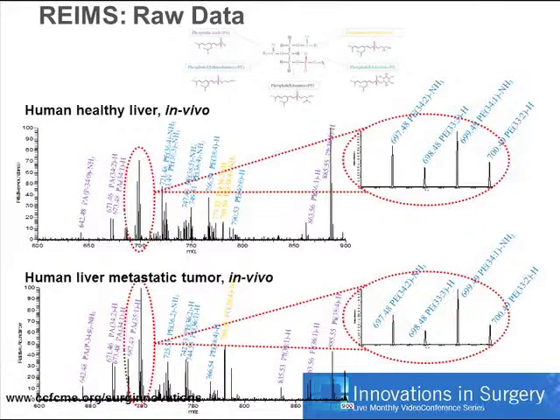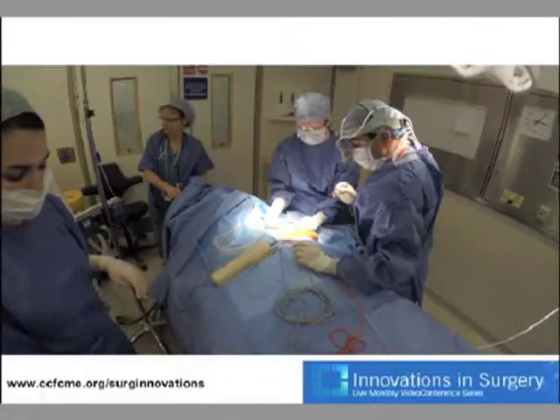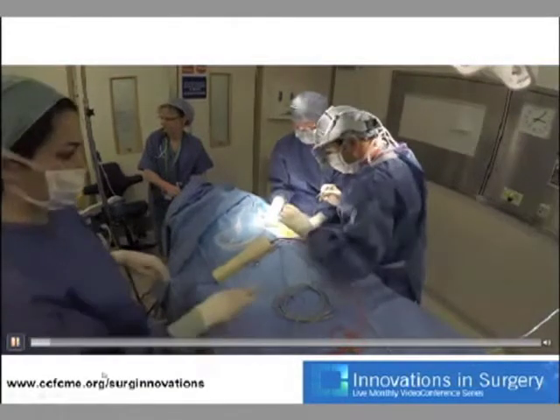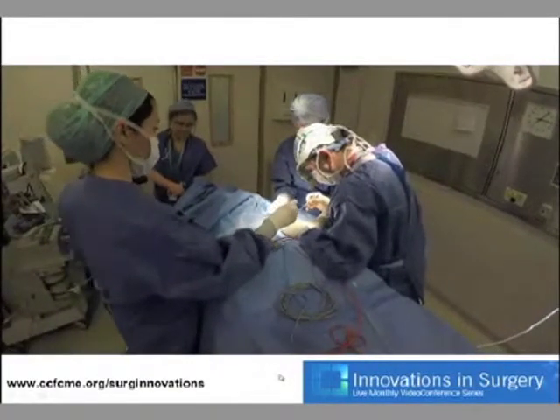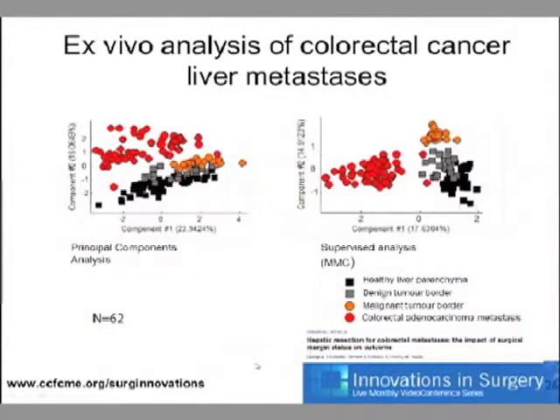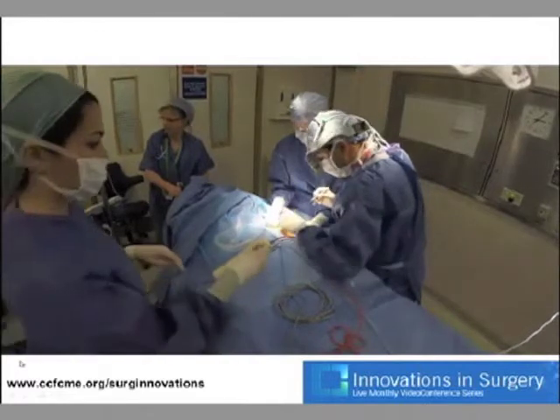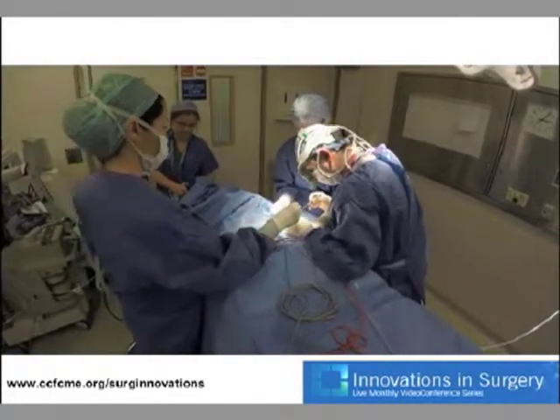Next slide. So this is the machine actually being used in practice. If you could play the video, apologies, it's a little bit jerky. But this is my colleague, Mr. Daniel Leff, who's one of our oncoplastic breast surgeons here at Imperial College, using the device. You can see he's doing the operation, it's a completely standard operating field. Nothing really changes for the surgeon.